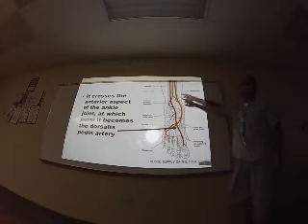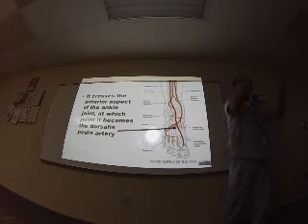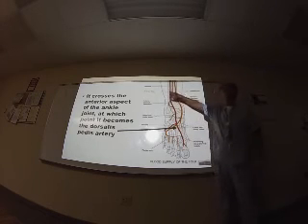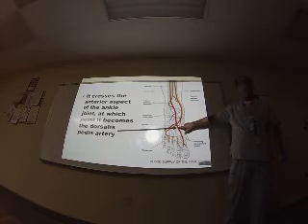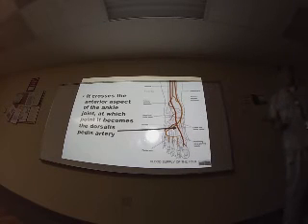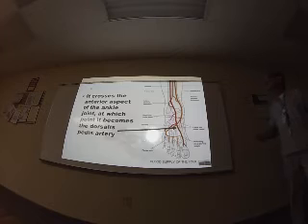Some people do not scan the anterior tibial artery, only the dorsalis pedis. That depends on the protocol. Different hospitals use different protocols. In general, I work without scanning the anterior tibial artery, because I scan the dorsalis pedis, which is the continuation. But that depends on where you're working. Maybe some protocols also use the anterior tibial artery, like Daniel teaches. I only teach with the dorsalis pedis artery.